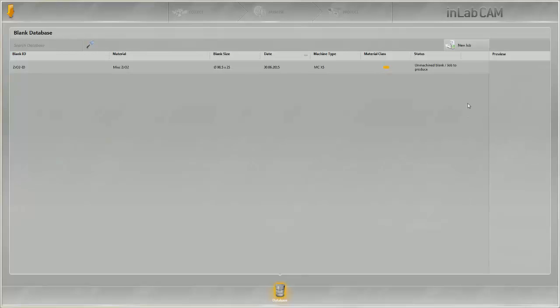These pieces of work can be either designed in the InLab software 15 and imported directly into the InLab CAM software or transferred as STL data from third-party software.